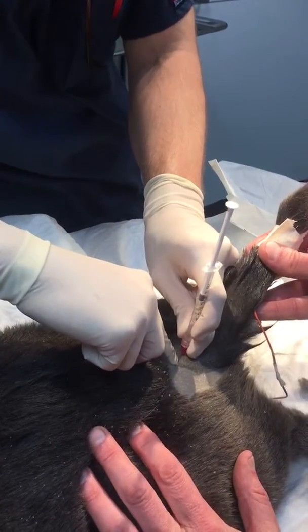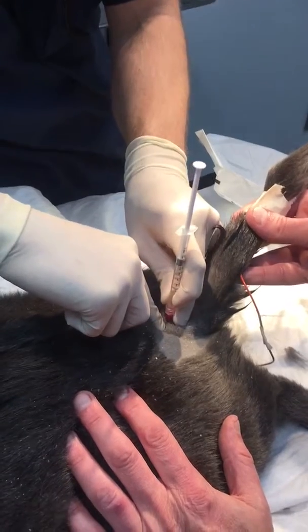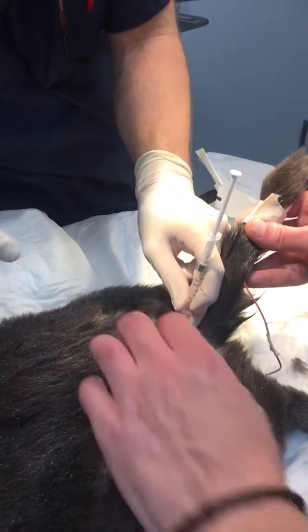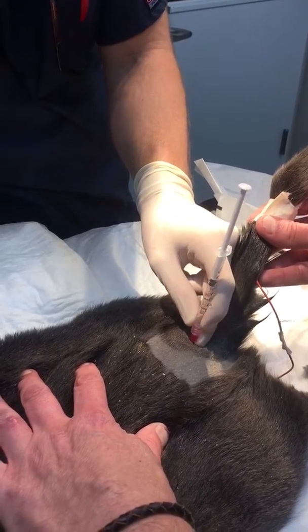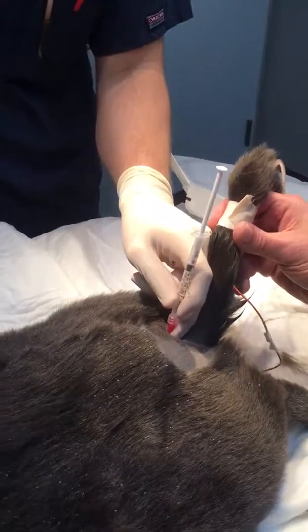Is that it? I think you're slim on bone. You look pretty high out. There you go. Am I off? Are you on midline? You're good — you're not going to hurt the cat. I went through, I just don't know if I'm off midline or not.